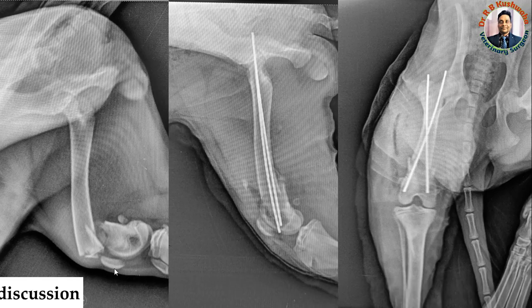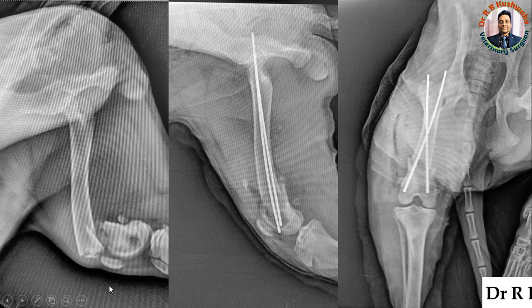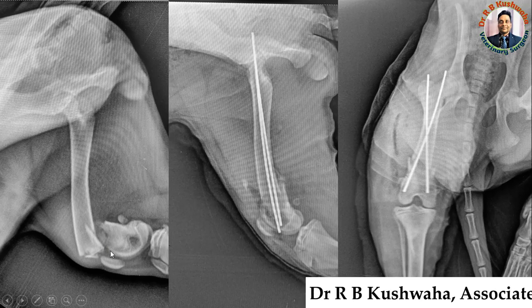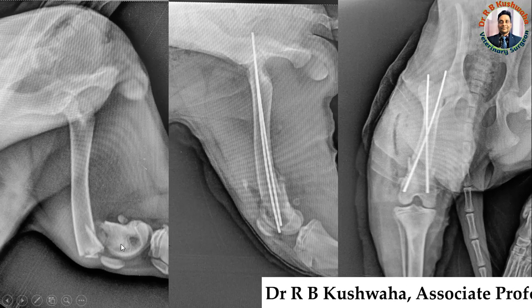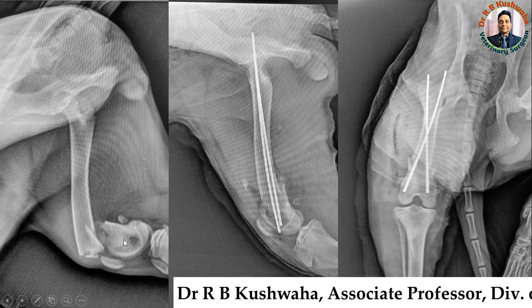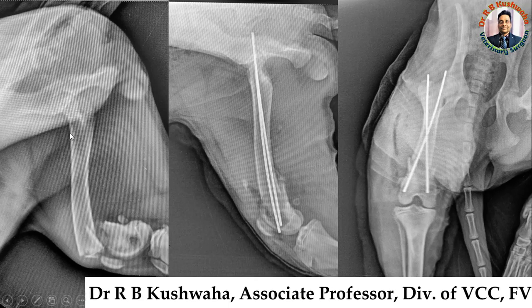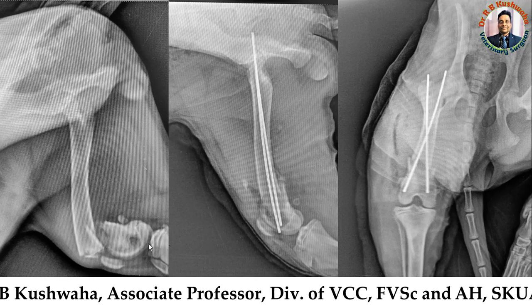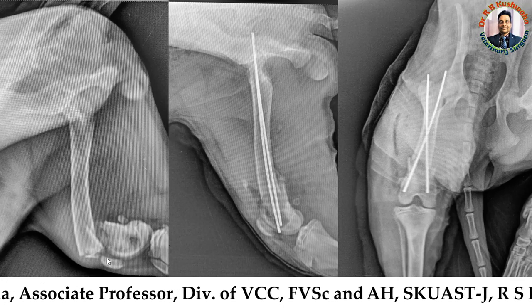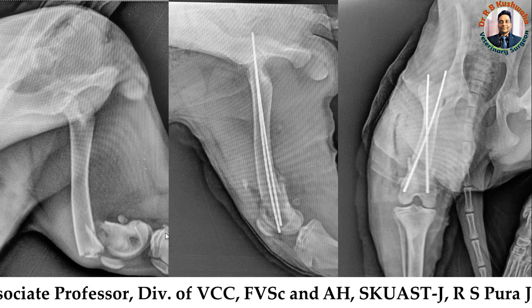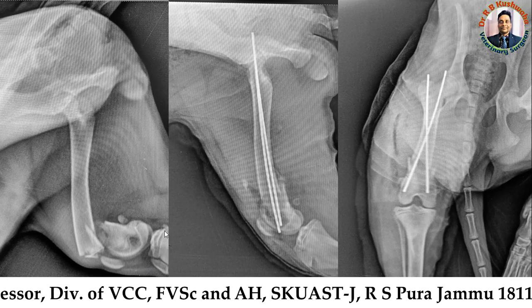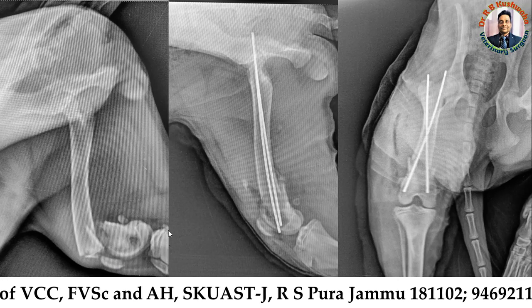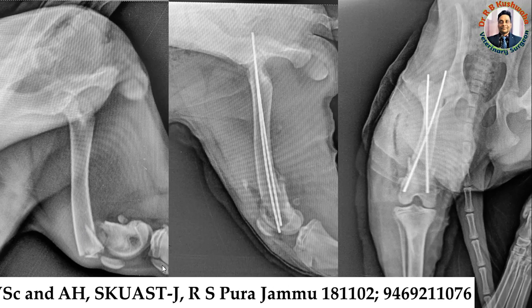This is the first case. You can see the pre-operative radiograph of the femur bone. The fracture is just above the condyle, which is why it is called a supracondylar fracture. This is the proximal fracture fragment and this is the distal fracture fragment. This is the patella. The physis, or epiphyseal plate, or growth plate, is still intact, indicating this is a young animal.